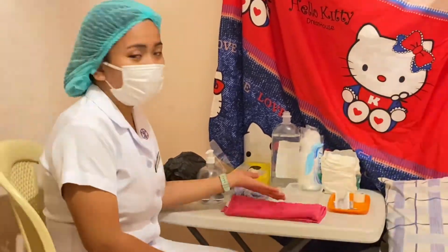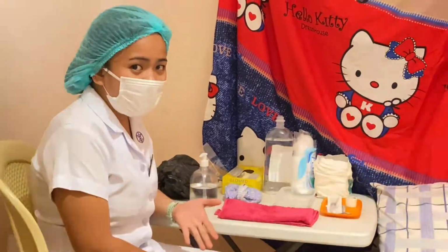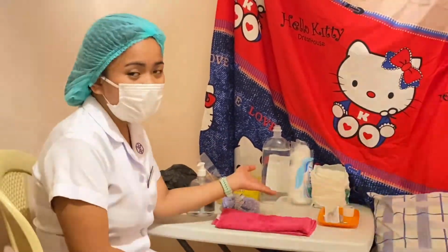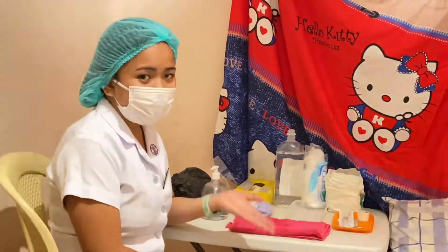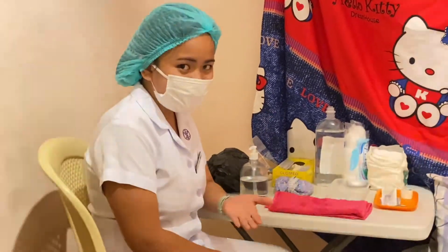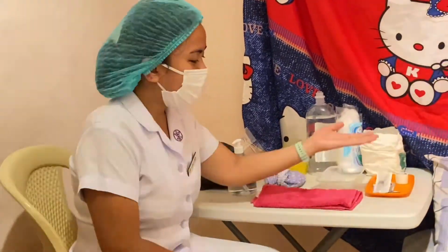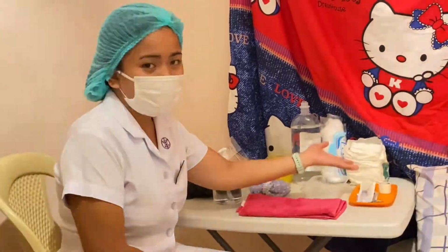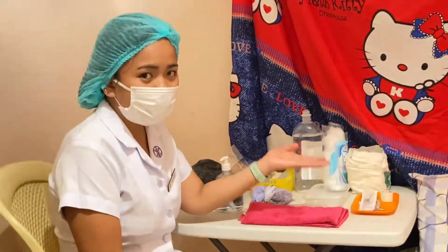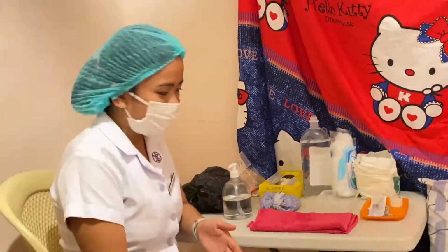So next, we have here kidney basin. If you don't have kidney basin, you can make use of a disposable Tupperware like this. That will serve as the receiver of the waste solution during the irrigation or the cleansing. Next, we have here a syringe, bandage scissor, bandage tape, and cotton buds that we'll use for the specimen collection depending upon the doctor's order for laboratory.